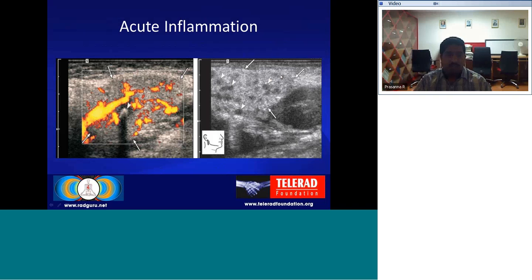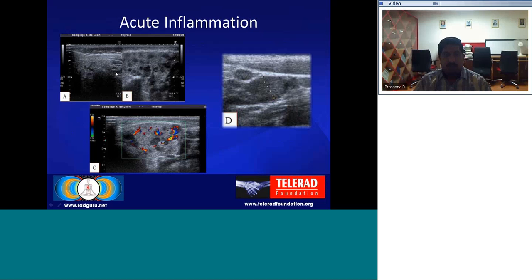So it is ideal for us, if the complaint of the patient is one-sided, unilateral, to always compare the gland with the contralateral side, so that we easily make out that the echo texture is different, and also it is edematous or enlarged, and hypoechoic areas, of course, can be seen with hypervascularity. Another image where the comparison is made is the right gland, the left gland. Clearly, the gland is enlarged, hypoechoic, with multiple hypoechoic areas, hypervascular, and an enlarged intraparotid lymph node.